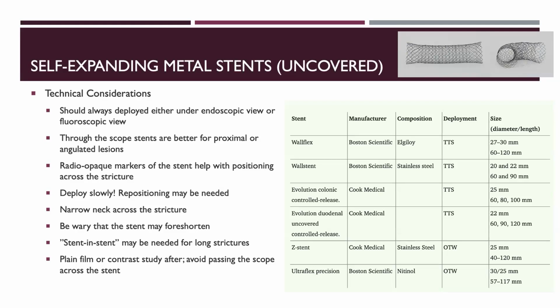Now, not all the stents have the radio-opaque markers at the same location. Most of them have a location at the point of no return. So meaning that the stents, as your tech is deploying them, there is a point of no return where you cannot recapture the stent.